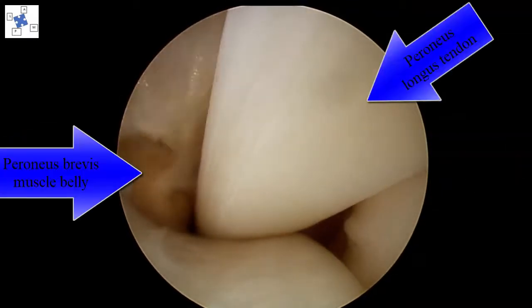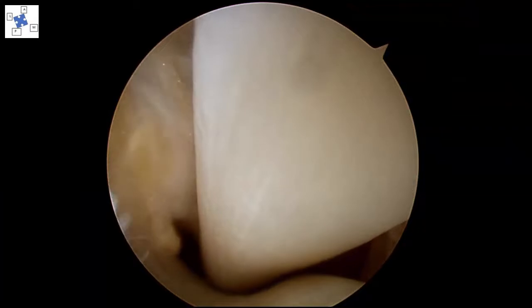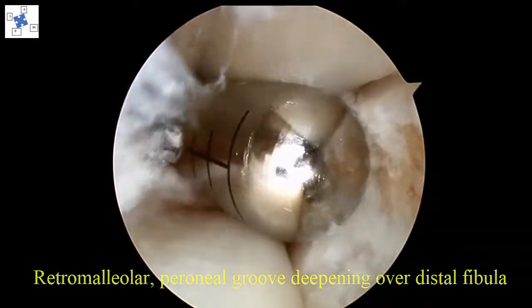The peroneus brevis tendon was identified by the presence of muscle belly, and the space inside the peroneal sheath was identified. There was a shallow and flat surface of the retromalleolar groove. Thus, endoscopic groove deepening and smoothening prevents subluxation and irritation of the tendons.